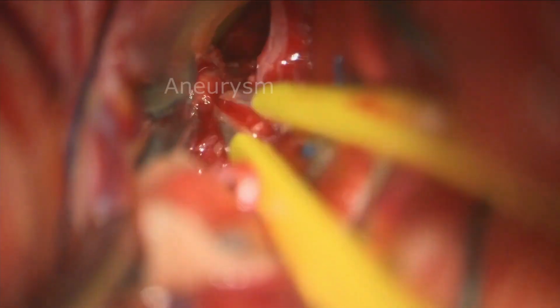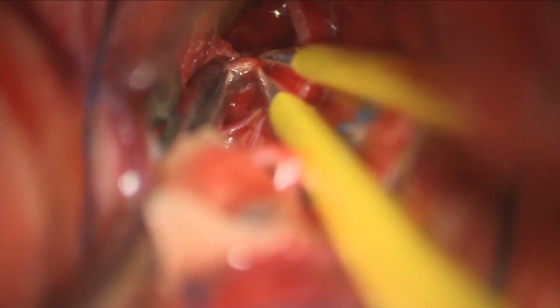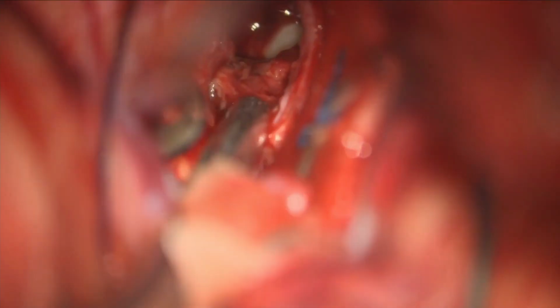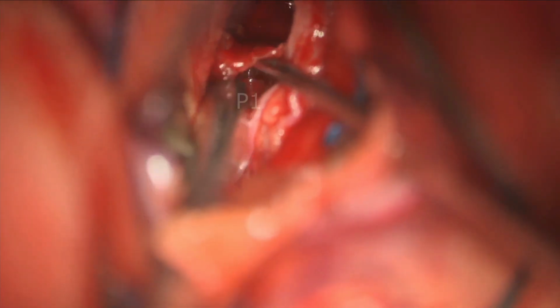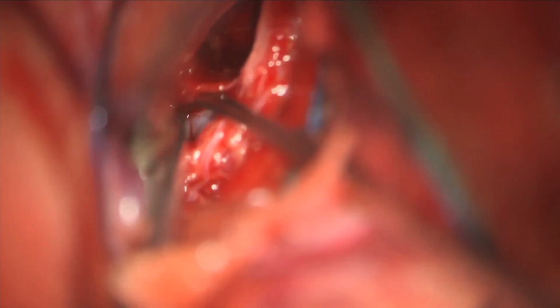Following this, we worked along the P1 segment, and we started to identify the aneurysm, which had a fair amount of fibrinous material consistent with recent rupture. Here we're lifting up some of that material to identify the neck on the near side. We can also see the P1 joining the basilar apex.